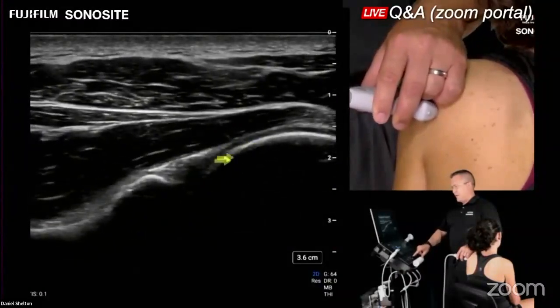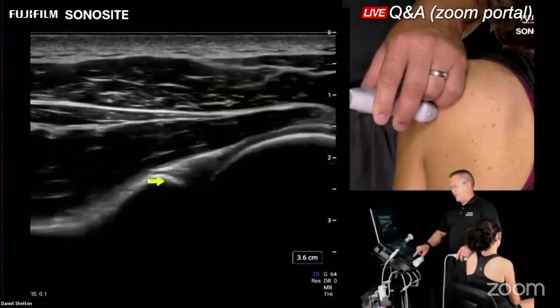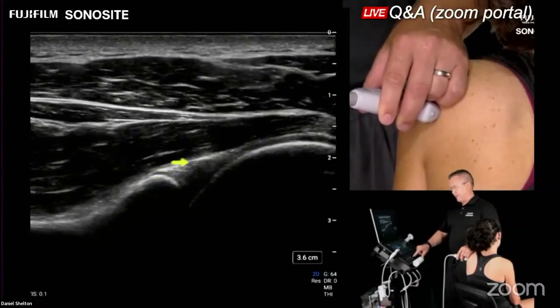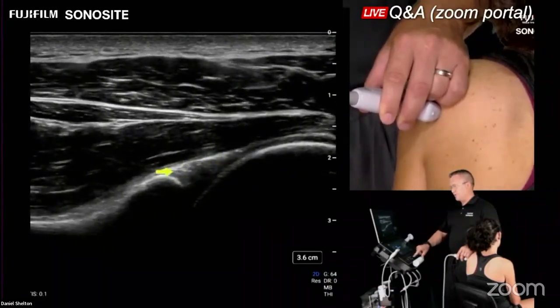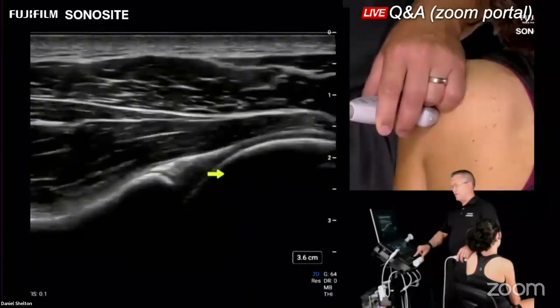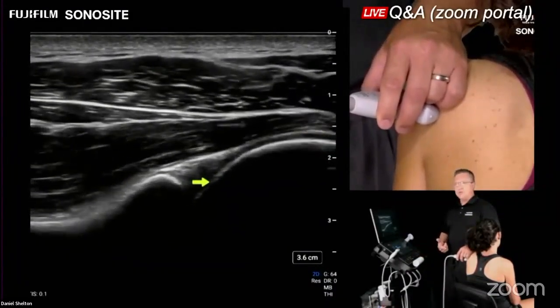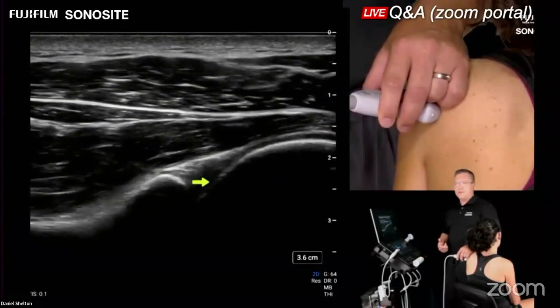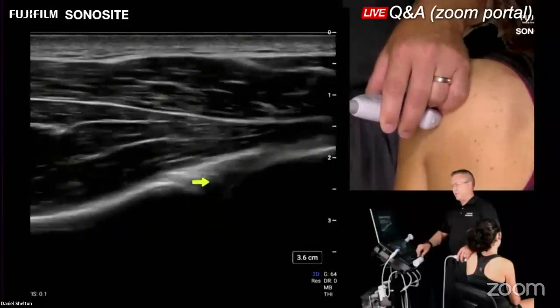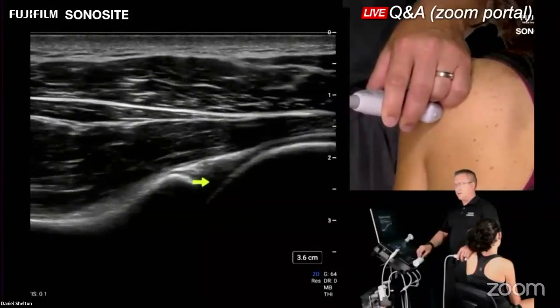So between the humeral head and the posterior glenoid tubercle, we have this labrum here. This triangular fibrocartilage of the labrum is shown really nicely on ultrasound, just in the posterior shoulder. Don't rely on ultrasound for anterior labrum. Don't rely on ultrasound for inferior or superior labrum. But posteriorly, if you see some pathology back here, you're probably not far off whatever the diagnosis is leading to.